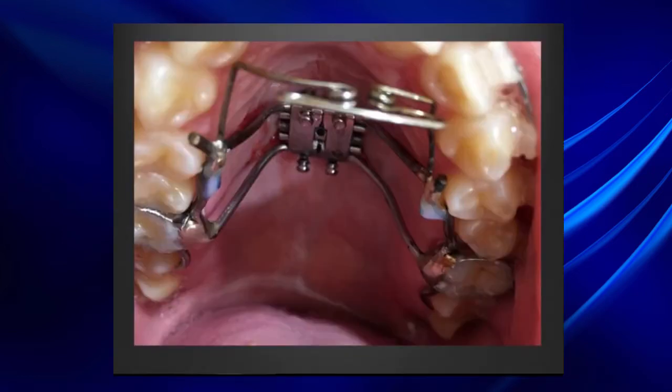Here is a tongue grille — an anti-tongue habit appliance — to stop the tongue from going between the upper and lower incisors. This habit control appliance is welded in place and helps keep the tongue away from the upper and lower incisors.